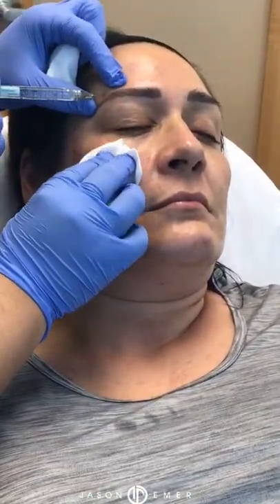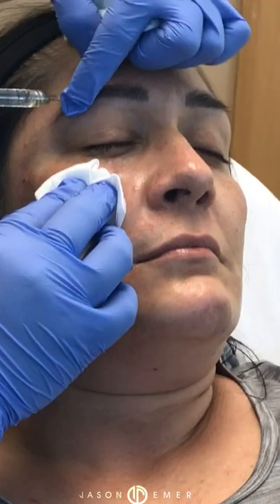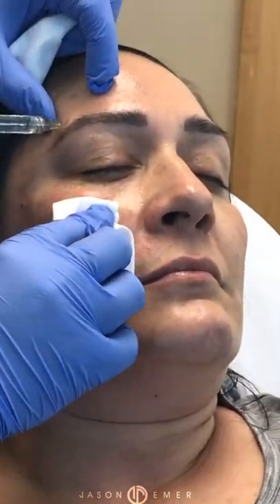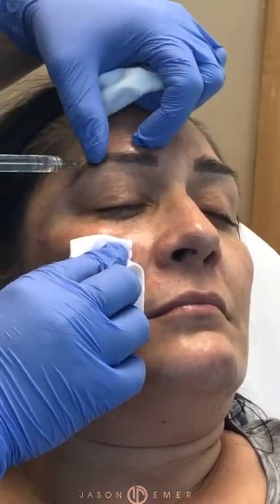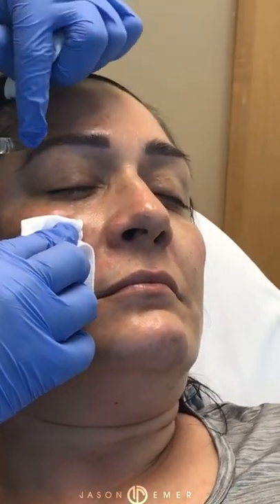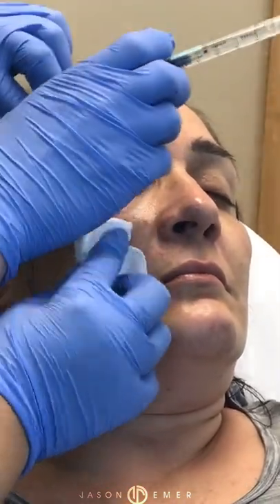Now we're going to come up right onto the bone here and just add a little bit of filler here. This is right at that arch most women call the gull wing part of the brow when we get that lateral third to lift. So we're just throwing a little bit of filler in there. And there's a space right here. If we place the filler there properly, it's going to just shrink. It's going to go right into the lateral brow and blend right in there. So push that down, and look at that lift. See that right there? That lateral lifting.